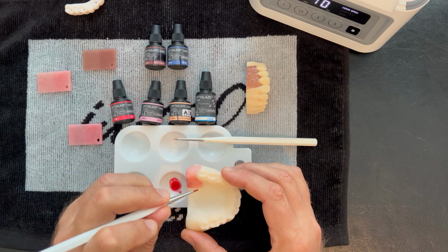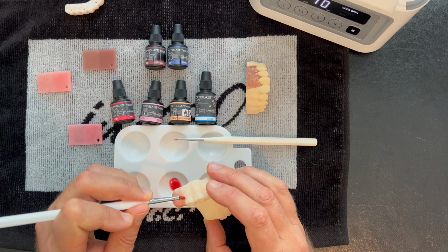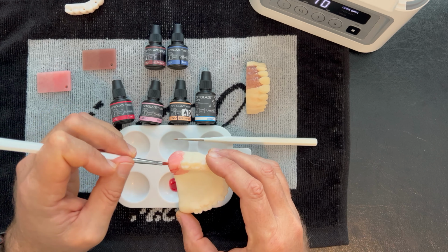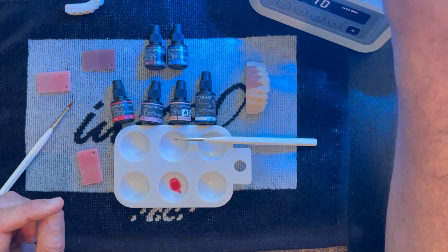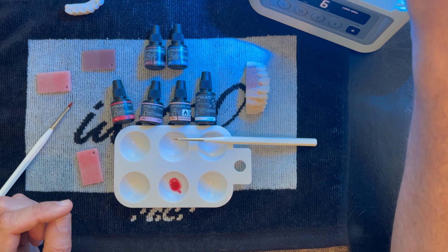Now, as you can see, you're not always going to get the intensity that you want on your first coat. And you can't just continue to put material on there because it can't stick to itself at this point. So right now, you see where we're at. For a lot of people, and depending on the shade of your print material or mill material, this might actually do it. But if you want more intensity, I'll hit it with a Labolite Duo for about 5 or 6 seconds.